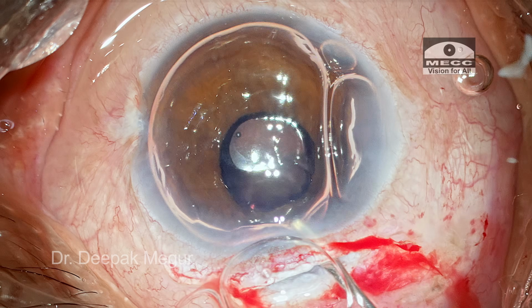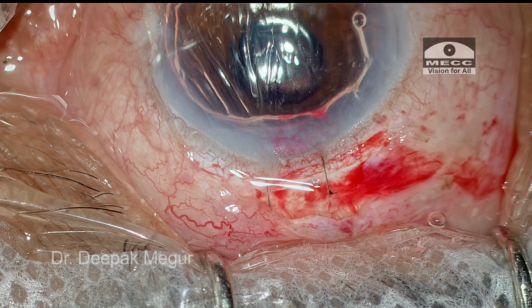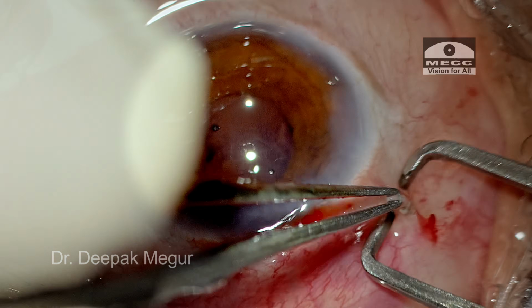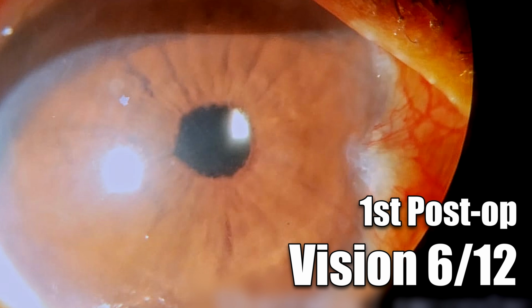Time to close. So I'm going to use 10-0 nylon sutures to close the sclerocorneal incision. The knots are then buried inside. The remaining ports are hydrated. The conjunctiva is closed. Intracameral antibiotics are placed, and that's it. The case is done. Now, these are the next day post-op pictures, and the patient is seeing pretty well.